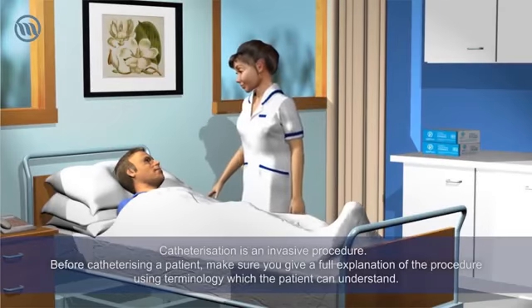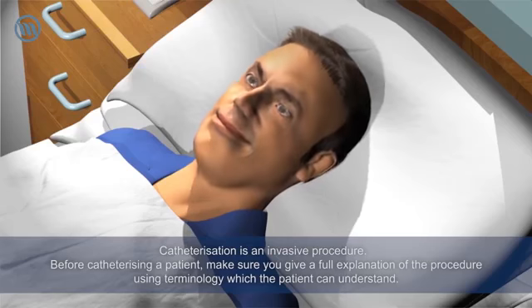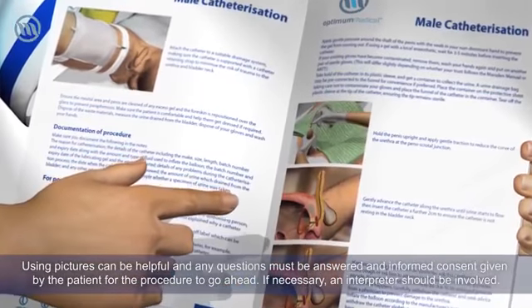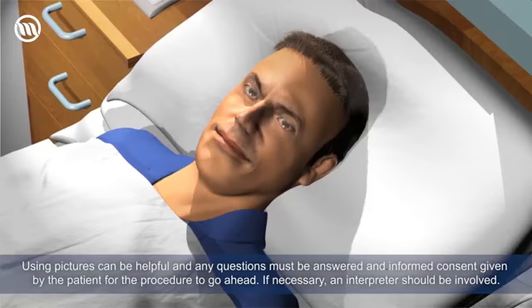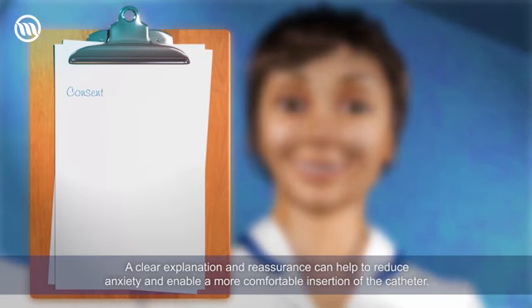Catheterization is an invasive procedure. Before catheterizing a patient, make sure you give a full explanation of the procedure using terminology which the patient can understand. Using pictures can be helpful, and any questions must be answered and informed consent given by the patient for the procedure to go ahead. If necessary, an interpreter should be involved. A clear explanation and reassurance can help to reduce anxiety and enable a more comfortable insertion of the catheter.